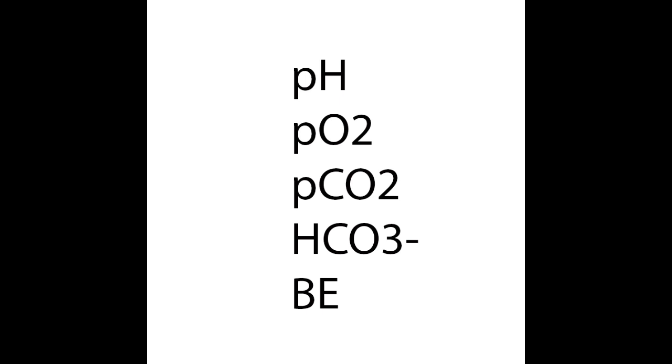Okay, so we have our blood gas results, but where do we start? Now most people tend to be drawn to the oxygen reading first, but I would suggest leaving that to the end. The reason for this is whilst oxygenation is important, you can get a reasonable idea of oxygenation from a pulse oximeter. It's not usually the main reason for doing a blood gas. Usually the blood gas is done to establish what's going on with the patient's acid-base balance. So that's where we're going to start.